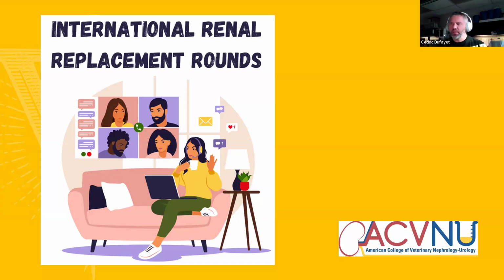So first of all, the Carpediem, and I'm not very familiar with that machine. I never used it. The one thing I know that is pretty peculiar about that machine, except for the small size and low flows, is that the dialysate and the blood are not countercurrent. They follow the same flow, which is kind of interesting, I think.